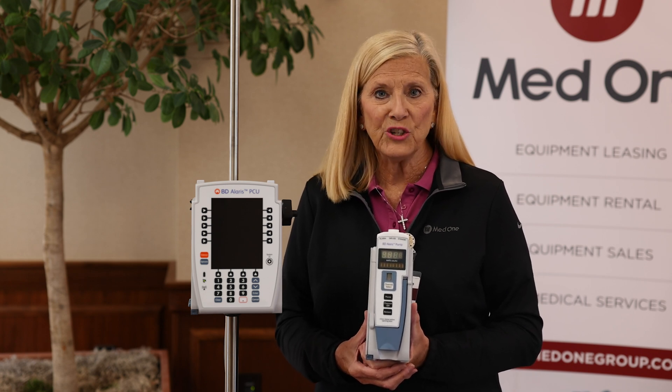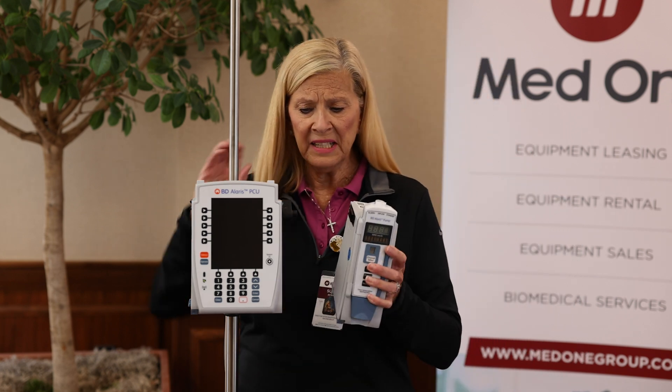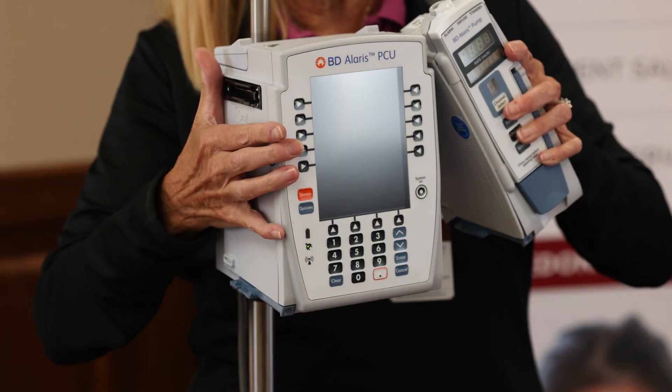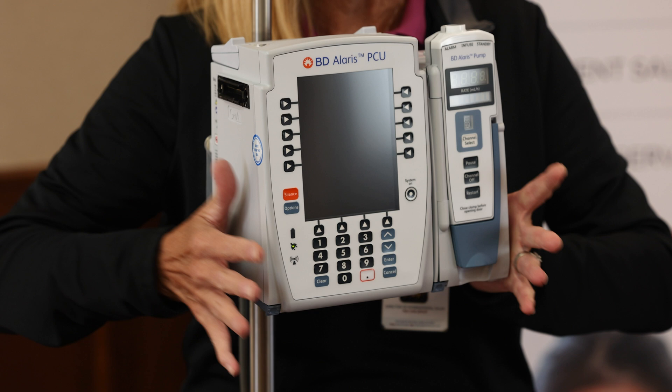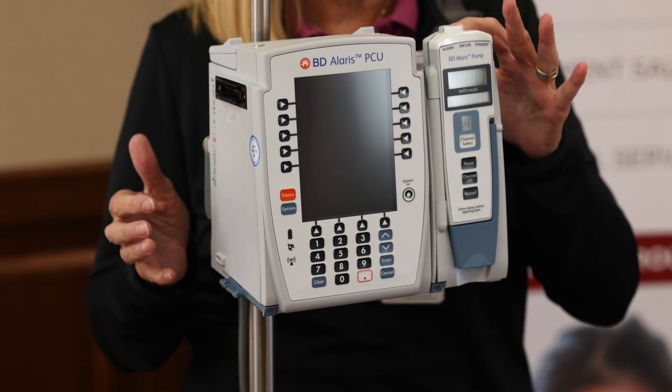You attach the large volume pump module to the PCU, and it attaches by what's called an IUI connector. You will cock it at a 45 degree angle, push down at the bottom, and hear that click. That provides connectivity between the brain and the pump module.